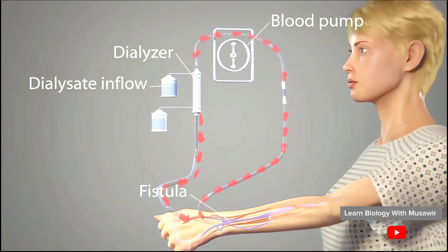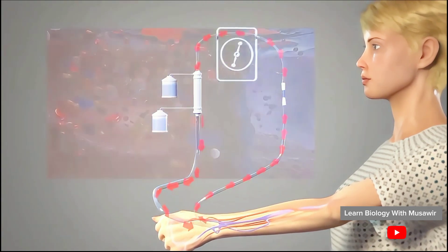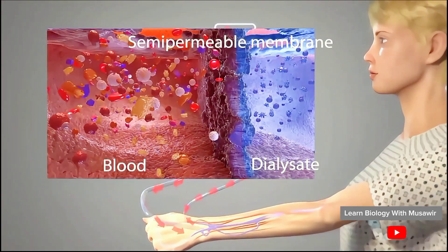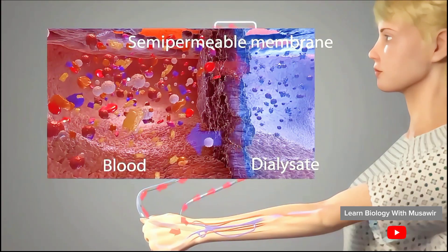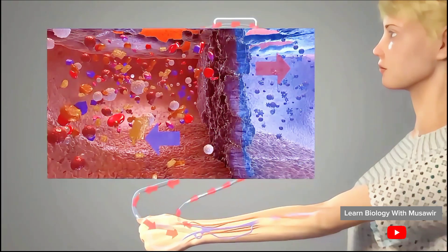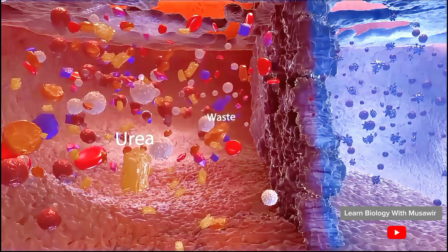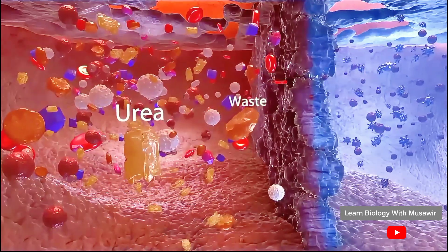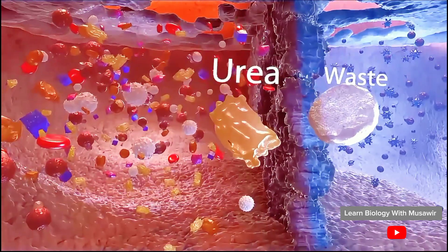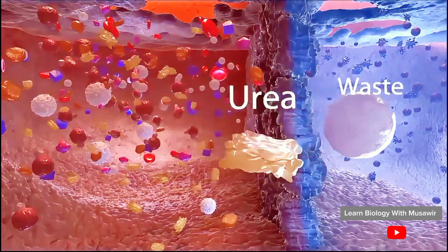There, blood and dialysate, or dialyzing solution, flow across a semi-permeable membrane in an enclosed container. This semi-permeable membrane lets urea and other wastes move from the blood into the dialysate. This movement takes place by diffusion because of the difference in their concentrations.